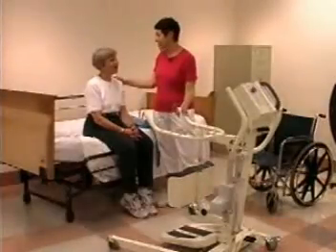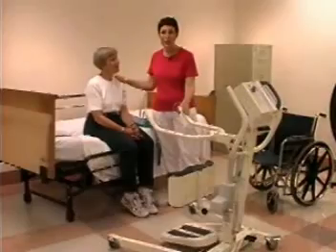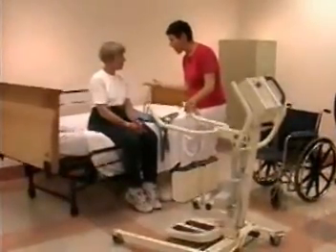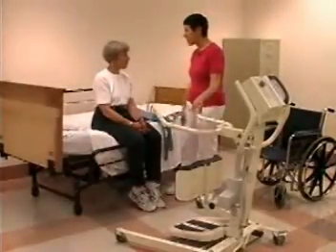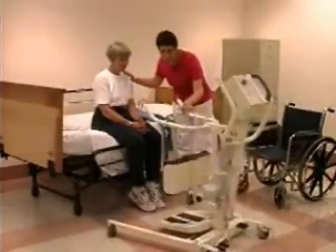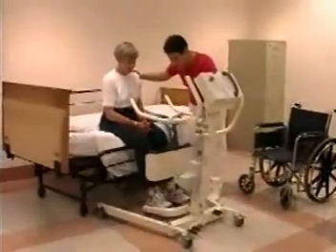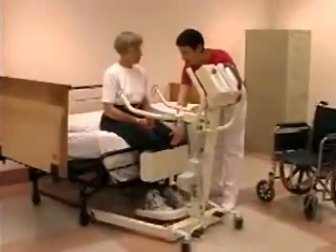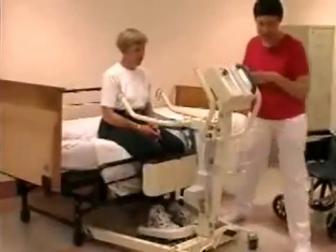Our patient, Mrs. Johnson, and I are now going to demonstrate the standing lift for you. Mrs. Johnson, this lift is going to lift you up from the edge of the bed over to the wheelchair. It's going to be comfortable and safe, and I'm going to explain exactly what you need to do. First of all, I'm going to be moving the lift closer to you, and I'd like you to put your feet on this platform. I'd like your knees to be comfortably up against this padded area. Okay? And I'm going to lock the base.